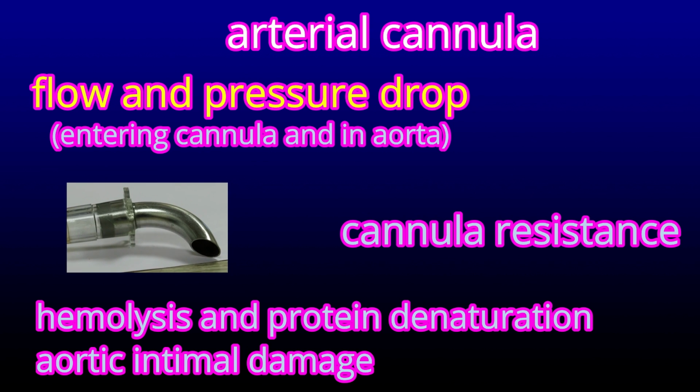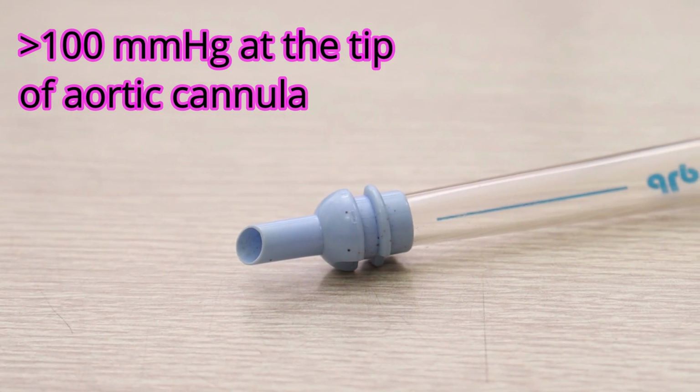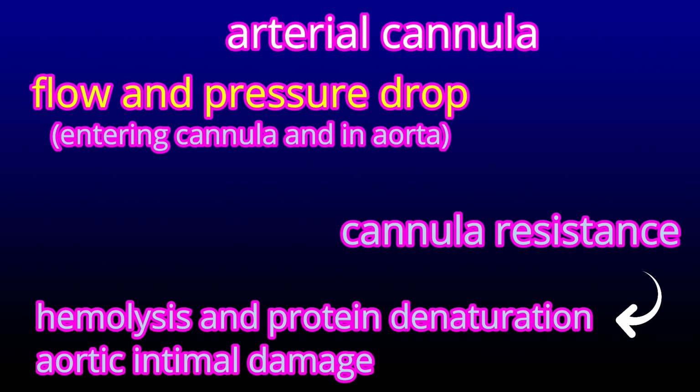Now, what is an increased gradient? Anything more than 100 millimeters of mercury at the tip of the aortic cannula is said to be an increased gradient, and an increased gradient will lead to hemolysis, protein denaturation, and injury of the aortic intima.